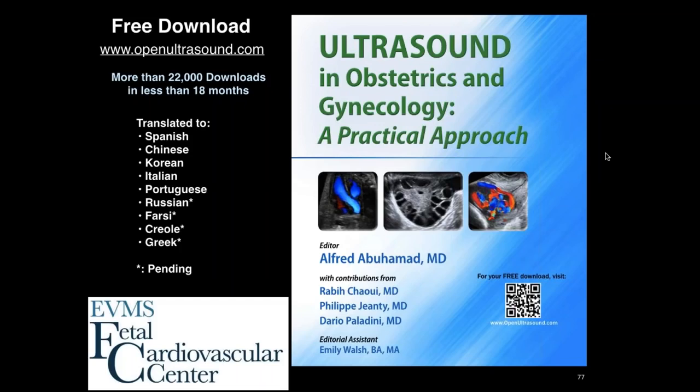I would be a little bit cautious about the sensitivity of this and the false positive. We are still counseling patients for an amniocentesis primarily rather than cell-free DNA. For ARSA, cell-free DNA, I believe, is okay if the patient is low risk, if everything else looks normal on the fetus. How early can the 3-vessel trachea view be seen?